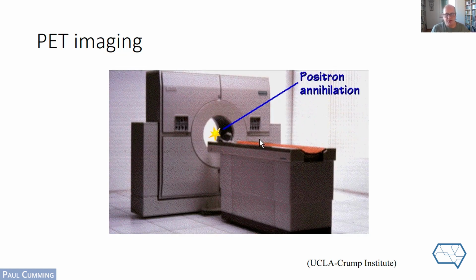And that positron annihilation here taking place inside the gantry of a relatively recent PET scanner, the one that they were using at UCLA about 15 years ago. That event takes place, imagine the patient or the volunteer lying in the scanner with their head in the hidden rings. Notice that modern scanners hide the wires nicely. That's a little bit of a joke, but inside that scanner, there are thousands of wires connecting all of the different detectors hidden inside the nice white chassis of the medical instrument.